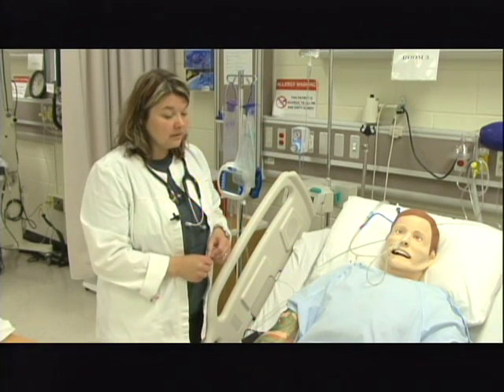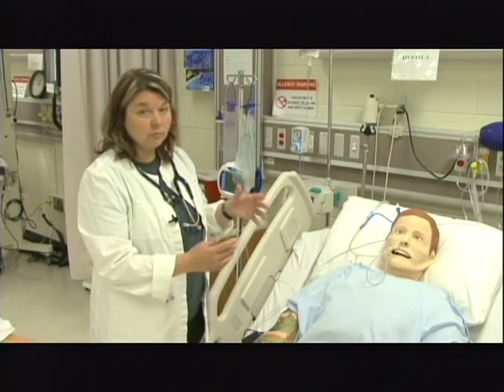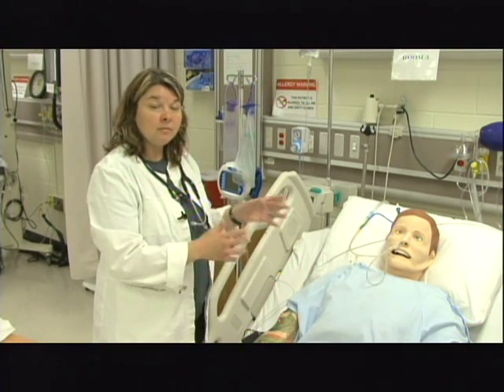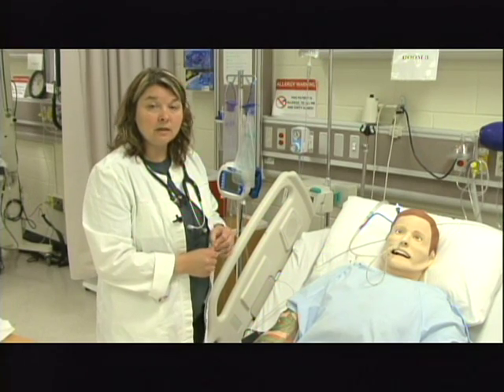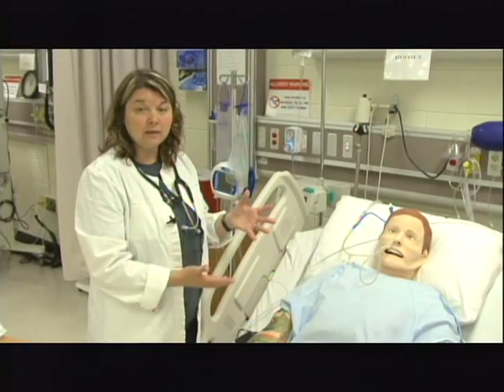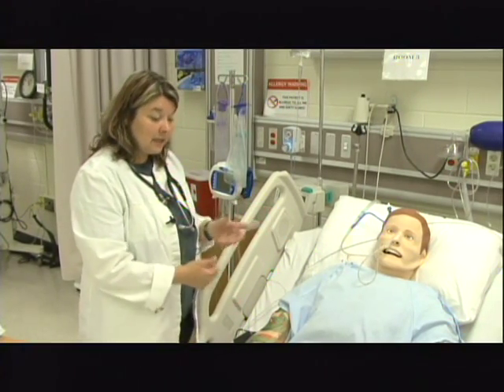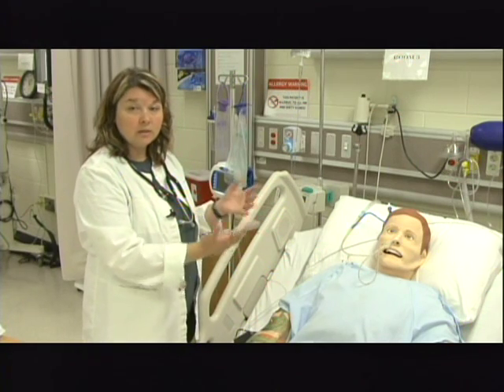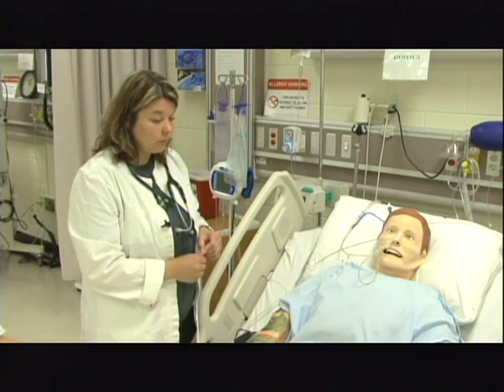There are a couple of other considerations. For instance, if your patient would have tube feeding going, you might need to hold the tube feeding for a certain period of time before and after the medications, depending on what it is, because it could interfere with absorption. One such medication is Dilantin or phenytoin. He is not taking any of those medicines, and he's not on tube feeding. He's on suction, so I'm going to unestablish suction in just a minute, and then we'll move on with that.